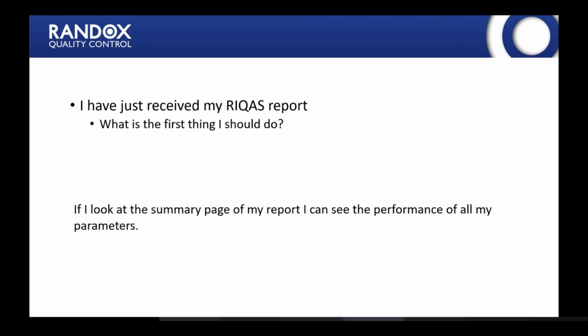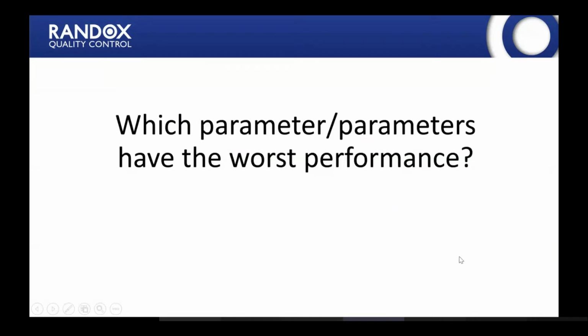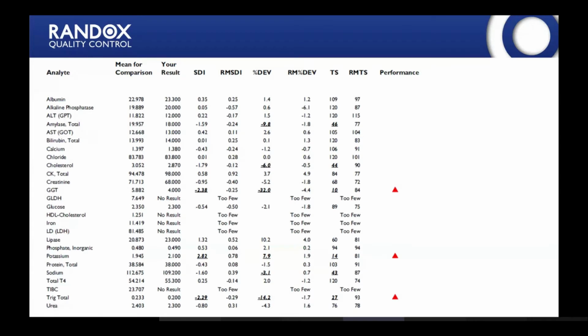So we want to look at the summary page, because that's where we get our overview of the whole sample and all of our analytes, and we can see if we have any performance issues for all the parameters. So we went through this with Stephen earlier, so we're just going to highlight quickly. Anything that's bold and underlined means it failed its performance indicator, and the red triangle indicates we failed all three. So the first thing we want to look at is our parameters with the three triangles.